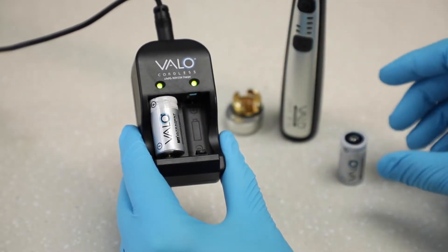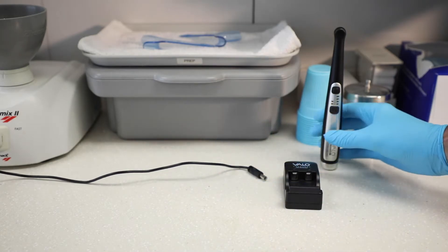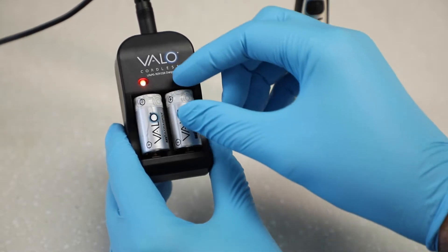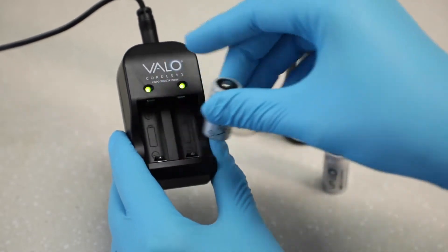Pay attention to the charger during charging and unplug the charger when it's not in use. Note: if the red light on the charger does not turn green when the batteries have been charging longer than three hours, the battery may be degraded or corrupted and cannot be charged. Replace with new batteries.